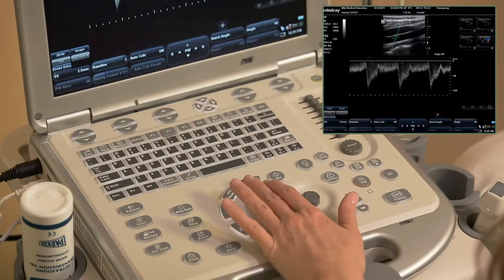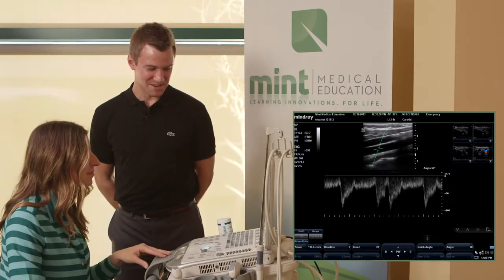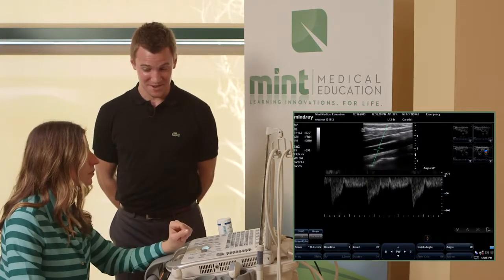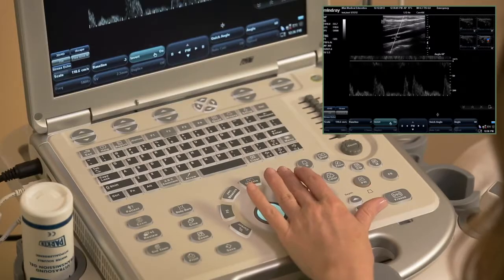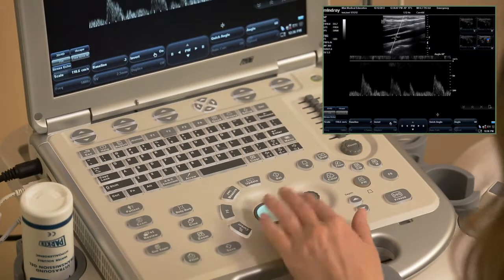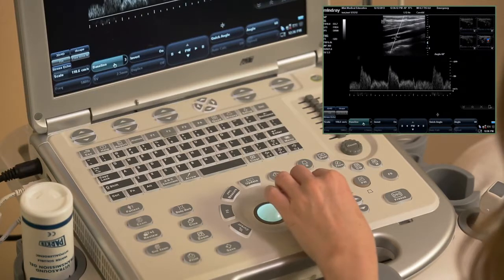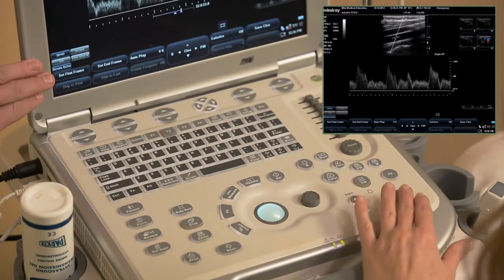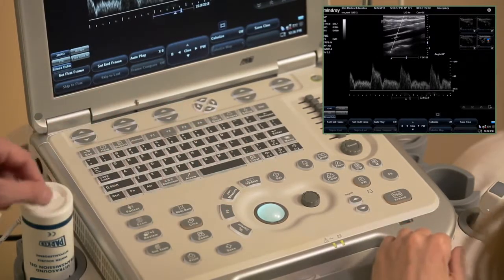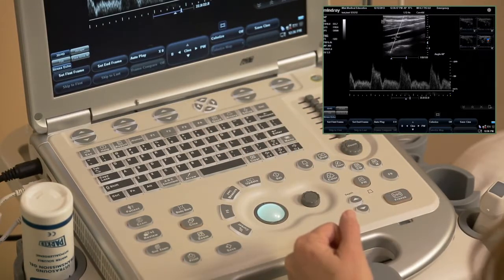Very good. Okay, so obviously you know what I'm going to ask you next. There are a couple of things that might be wrong with this image as you're looking at it. To make those adjustments, what we'd want to do is probably invert the pulse wave waveform sample, and then we also want to adjust the baseline, because that won't give you very accurate information. Just like you're doing and how you've done these adjustments on these soft keys on the menu, you're using the trackball and the set key. You could have also used those soft keys to make that adjustment up and down on the baseline.